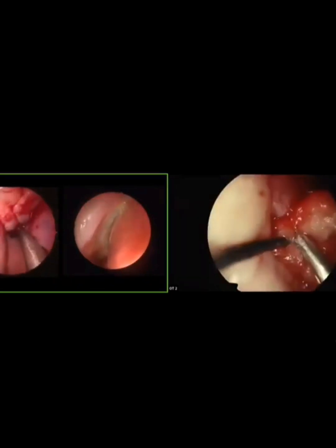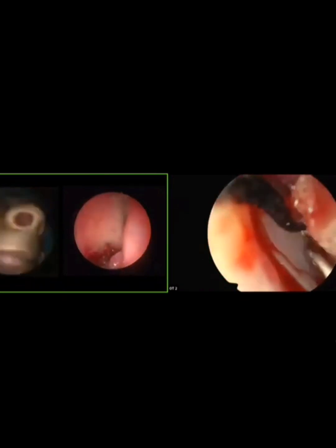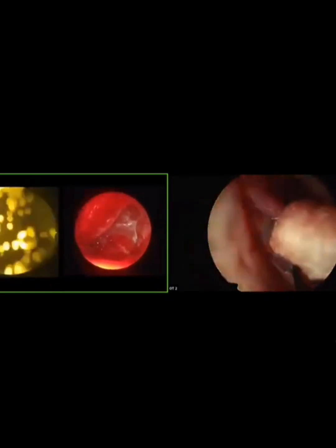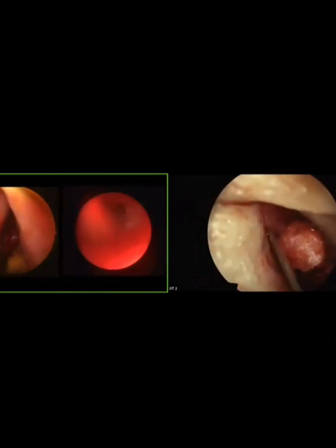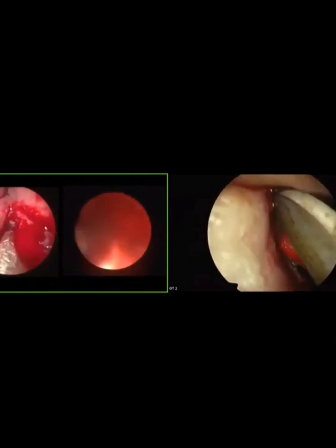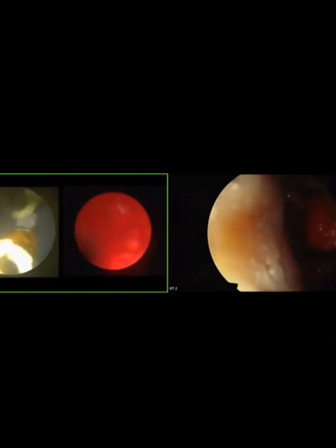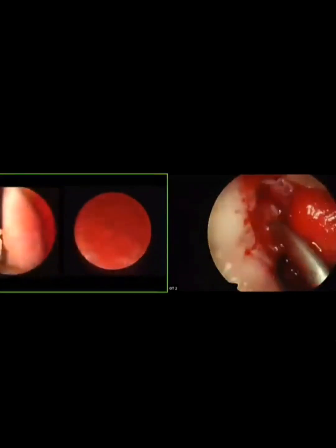How to use 70-degree? See, first face the 70-degree superiorly. Okay. Then enter, and while you are reaching the middle turbinate, turn it laterally, okay. For juniors, turn it laterally, okay, like this. All these are edematous mucosa. Wash, fast wash, full wash, okay, good. Lot of mucopus there. Wash inside, no? And the roof in posterior inferior part. Yes, sir. I will give wash there also, sir.